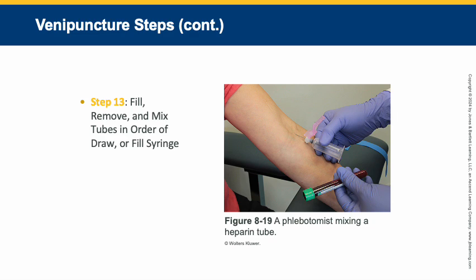Fill all the tubes, remove and mix the tubes in the order of draw, or fill the syringe if you are using a syringe.